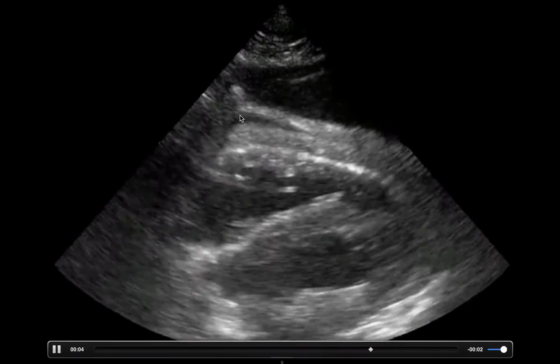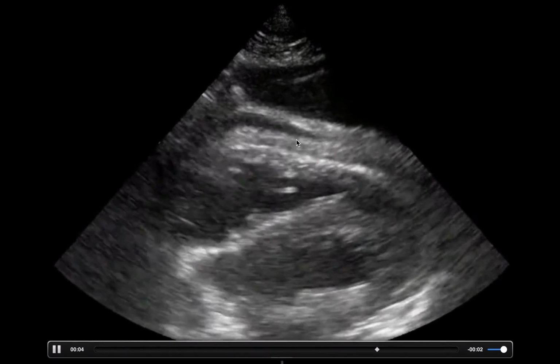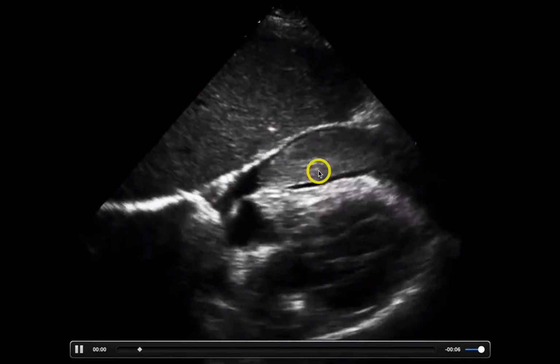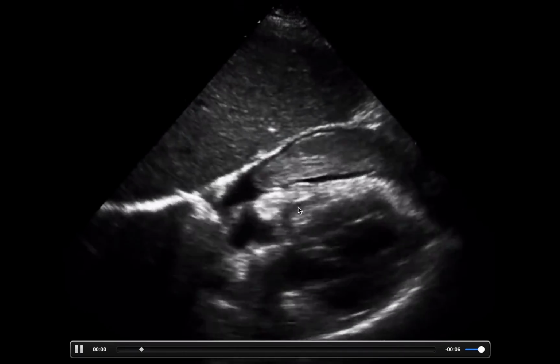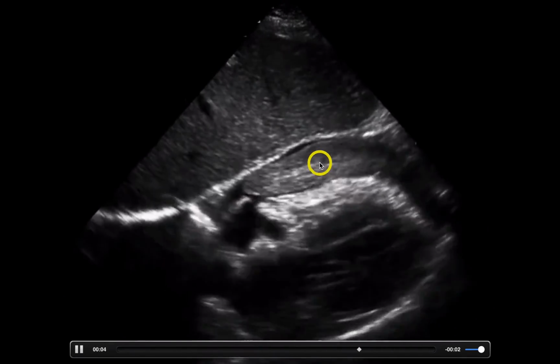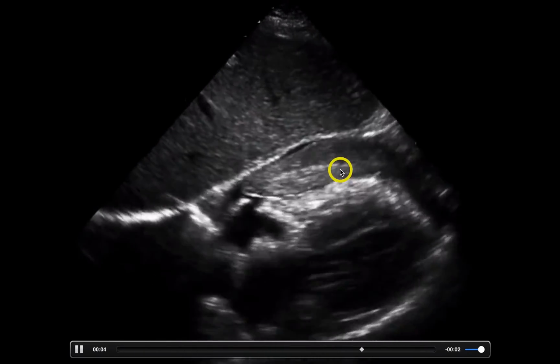Now, some people talk about the echo texture being important, and it is, but this echo texture can be what clotted blood looks like. For example, look at this heart with really bad tamponade. This is that same echo texture of that epicardial fat pad, but obviously this is an abnormality. This right ventricle is completely gone. It's completely obliterated. This patient has tamponade, and this echogenicity looks like that echogenicity of that fat pad. The difference is it's not adherent to that RV free wall, and it's kind of moving independently of it.